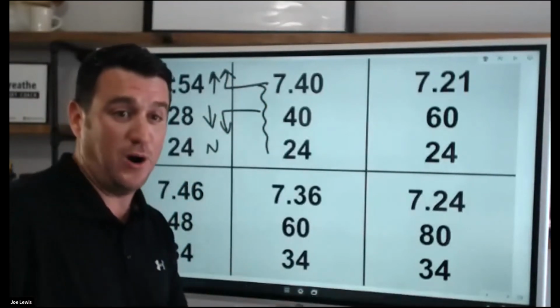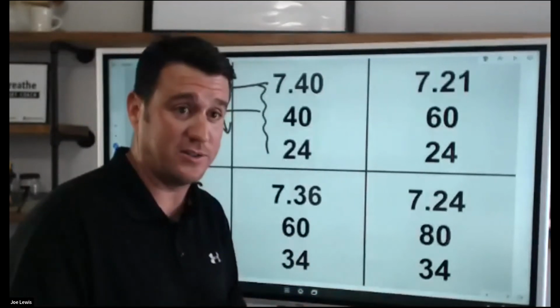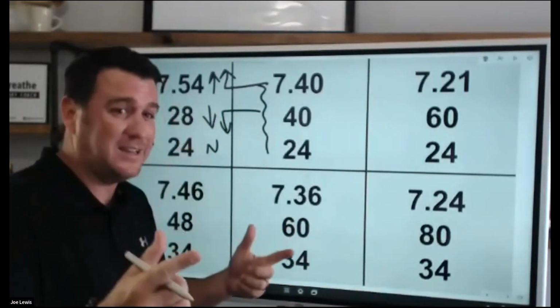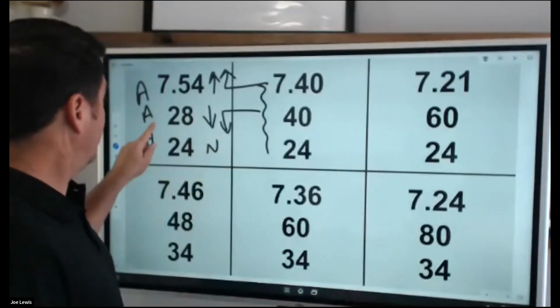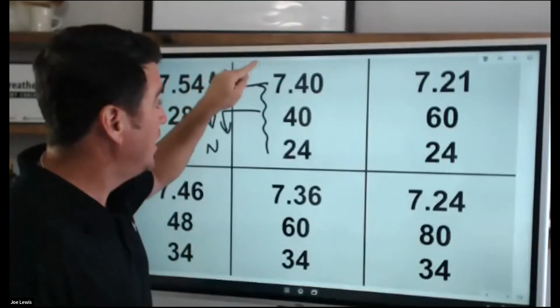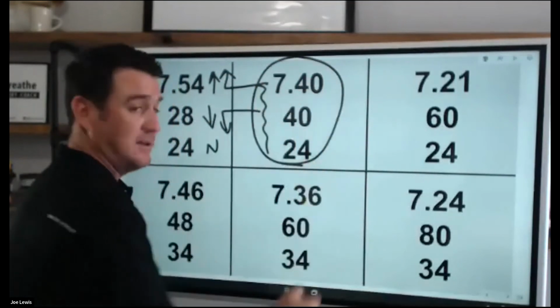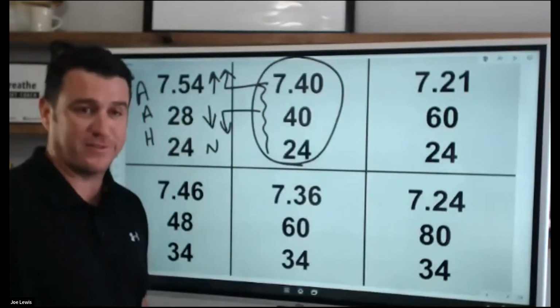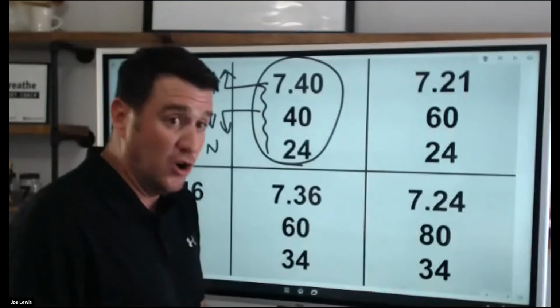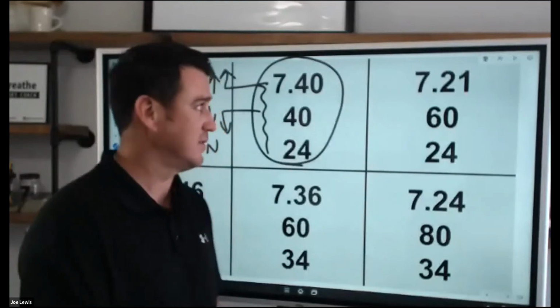Now, if the superimposed part challenges you, then this is the way I like to talk about this, but I will caution you, don't ever say this to a physician, okay? Don't ever say this to another respiratory therapist. In your mind, what you know is you can go, this is acute alveolar hyperventilation superimposed on normal. That's all it is. It's just saying this person lives at a normal state. So we just call it acute alveolar hyperventilation. We don't have to say superimposed on normal because it's assumed that it's on normal unless we indicate that it's on top of chronic ventilatory failure.